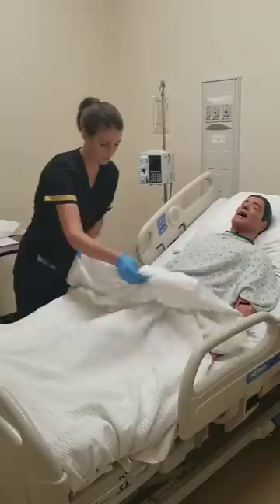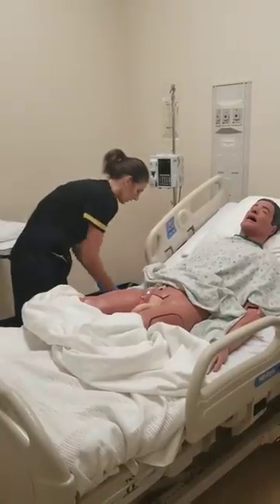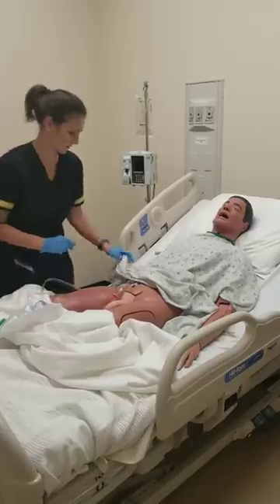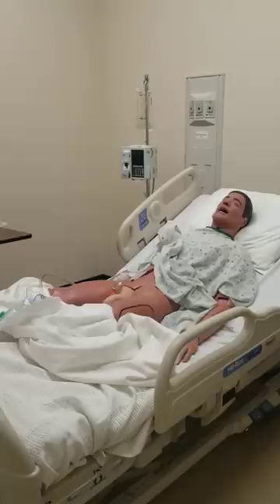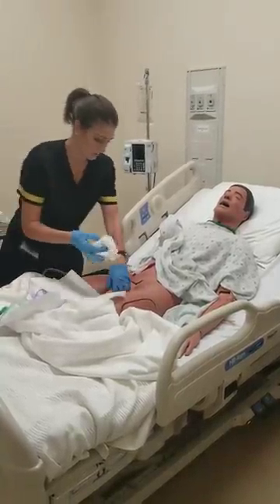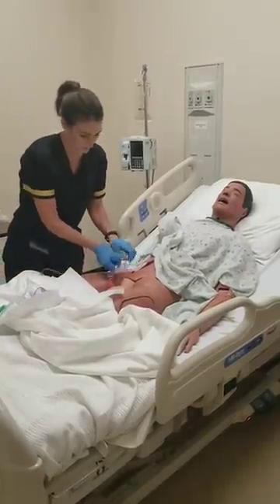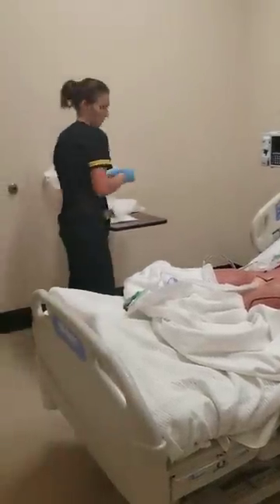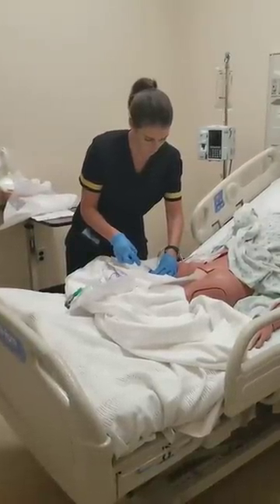Go ahead and get you uncovered. All right, I'm going to go ahead and empty the bag before I start anything. Okay, and we're going to untape this from, well, I'm going to go ahead and clean you up first. It's just soap and water again. We're going to untape this from the abdomen, and I need to deflate that balloon. I'm just going to make sure that I draw all 10 milliliters.